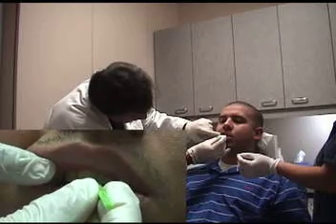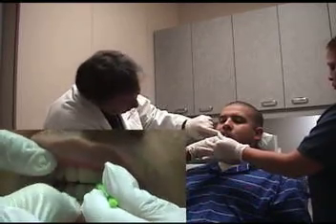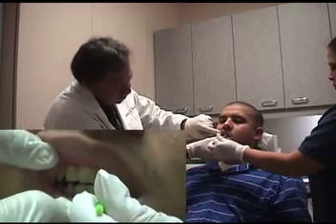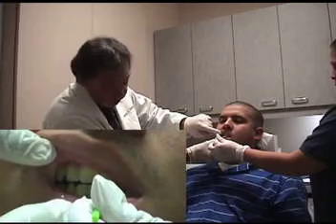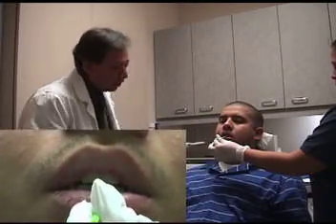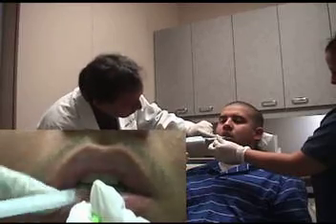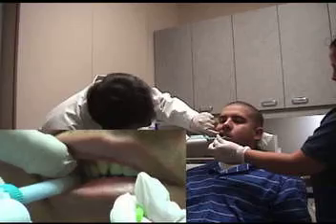Tiny bit more. There you go. Okay, if we can hold that position without moving, you can see that we have about the same separation as we did in the speech position. Now, it's important the number that you pick to hold the relationship. For instance, I had him stop at 69.